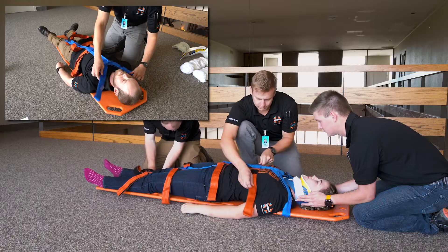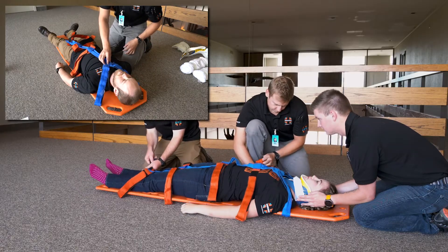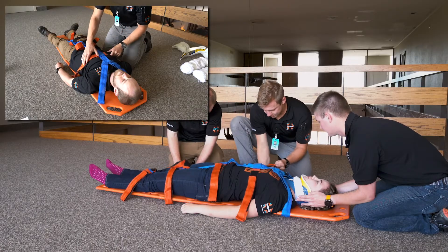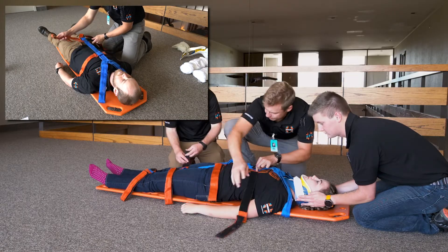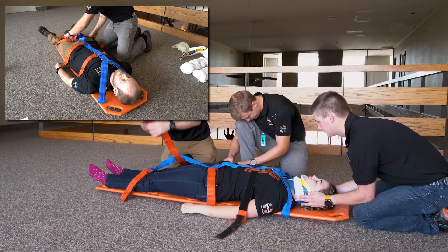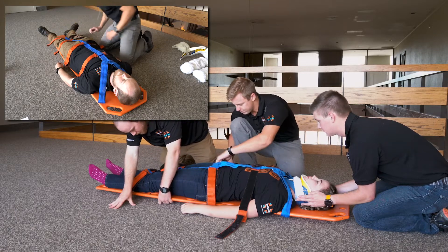When placing the straps, locate the center of the shoulder straps at the patient's sternum and make sure to put the straps over the patient's structures you wish to support, including the thoracic area or ribs, pelvis, mid-thigh, and lower legs.